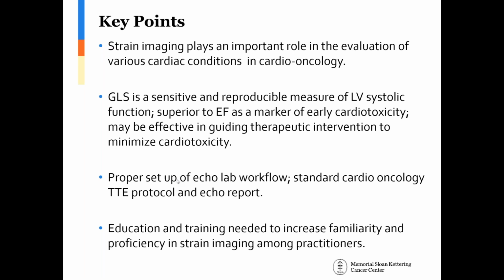And I think you need a minimal competence of 50 analyses per year to be competent in measuring strain. And remember, in the SUCOR study, and you'll wait for the results and interpret them yourself, we did strain at 28 different centers across the world, and each center measured strain and acted on the strain based on their own measurements, not in a core lab setting.